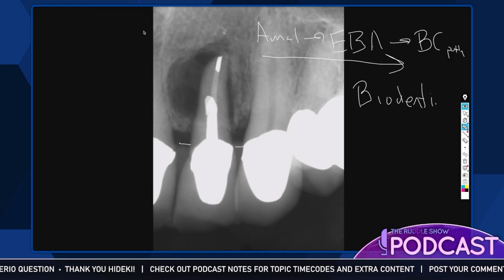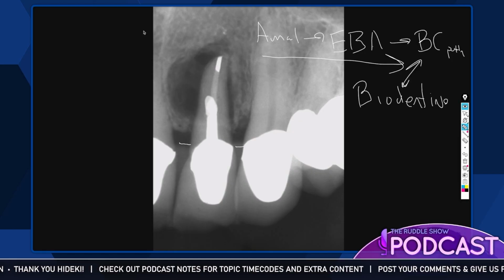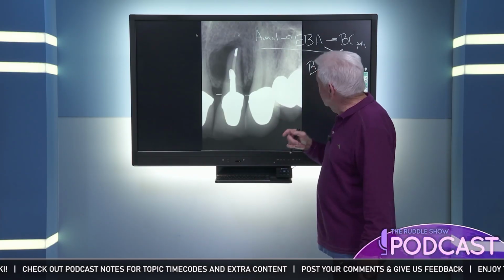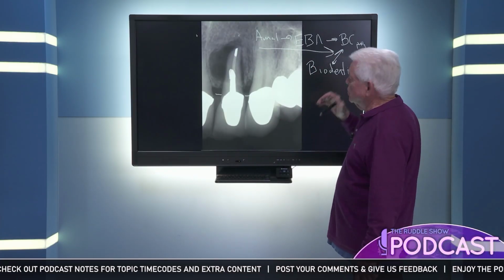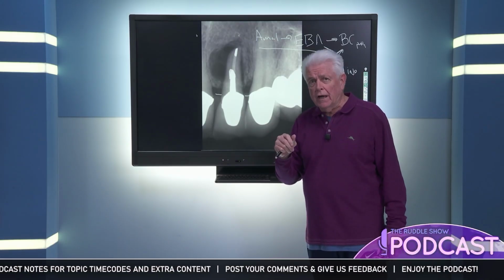And these two can be thought of as very similar. They're both bioceramic materials. They're both putty type stuff. They have body. You can pack them and move material. We showed that Hideki using, as he called it, the EndoSequence root repair material. That's what he used in the palatal canal only.